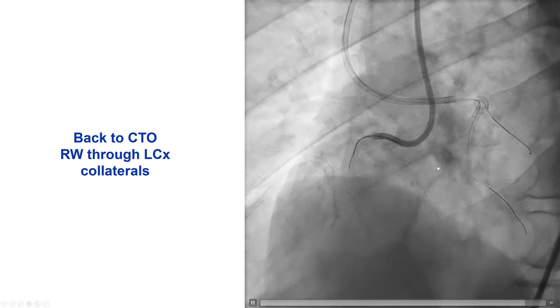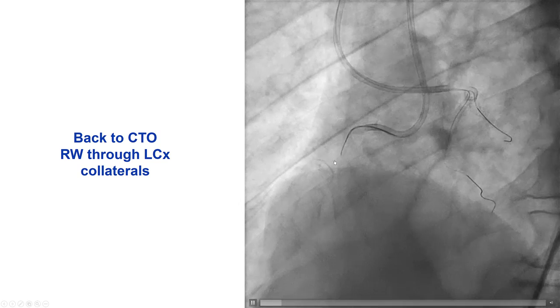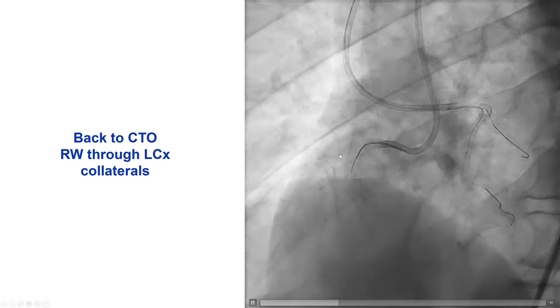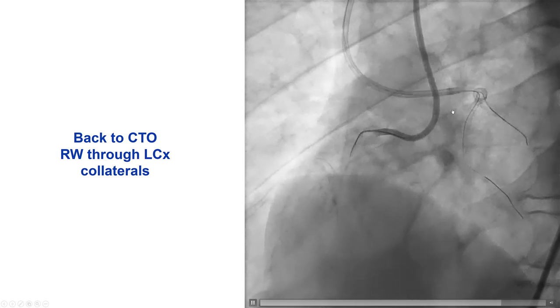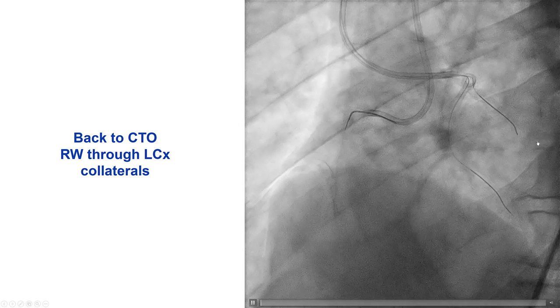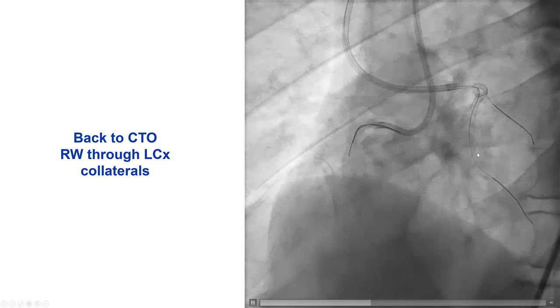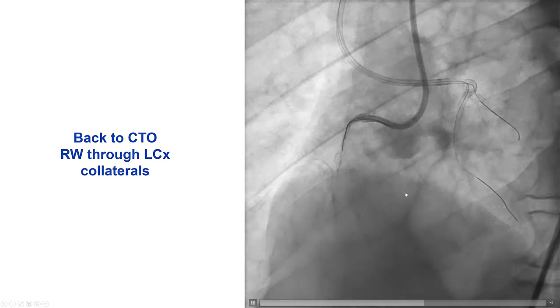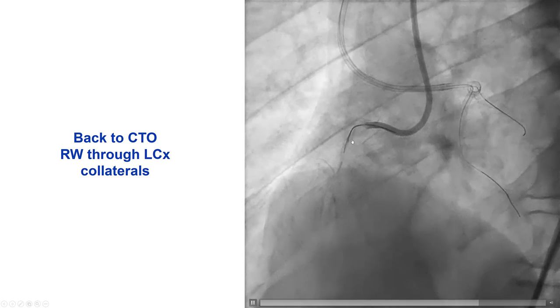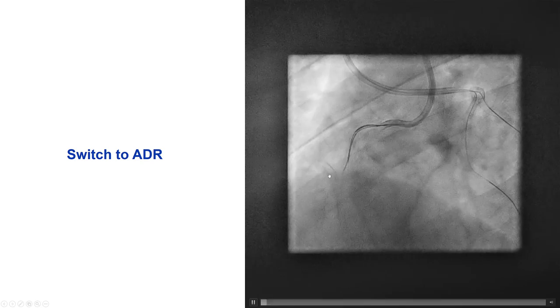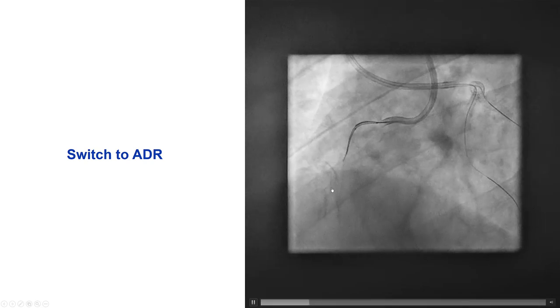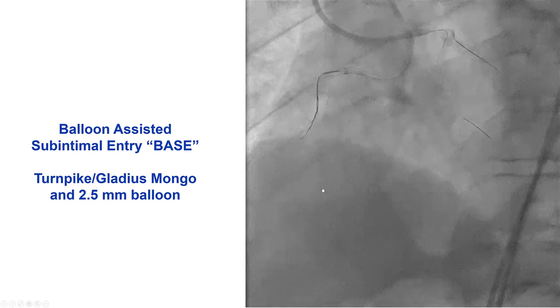We then decided to go back to crossing the RCA. We had a brief attempt going retrograde through the epicardial from the circumflex, which was not successful, and then went back antegrade again. We had difficulty crossing the proximal cap and switched to antegrade dissection and reentry.